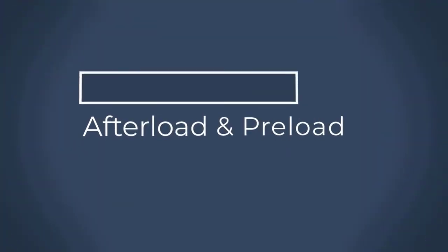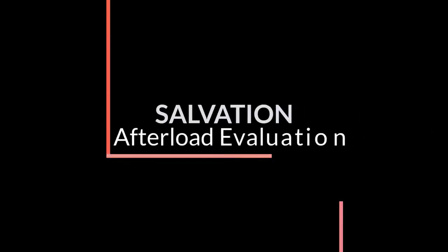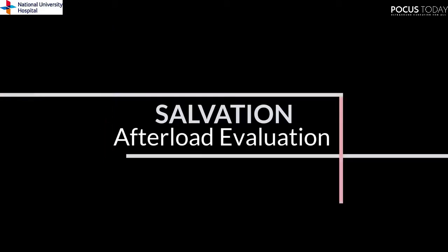Welcome to Part 2 of the Salvation Protocol. Part 2 describes evaluation of afterload and preload in hypotension and hypoxia. Let's look at afterload evaluation first.